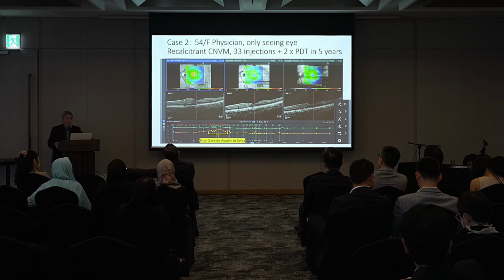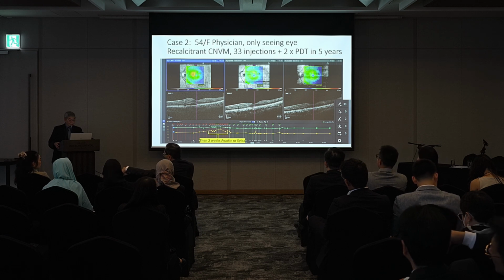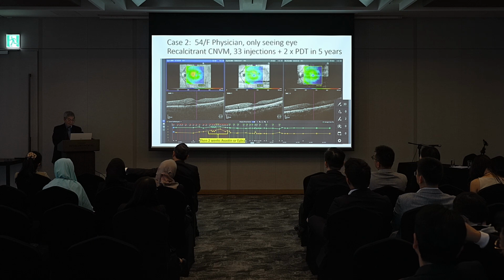The second approach, I think, here would be to do an FA-ICG again. In some of these cases, they may have polypoidal choroidal vasculopathy, and then locating these polyps, closing only the polyps down with half-fluence photodynamic therapy, I think would work in trying to achieve quiescence without the risk of RPE atrophy. So I would revisit if this patient had been treated so frequently and also at some point done an FA-ICG to look for polypoidal.